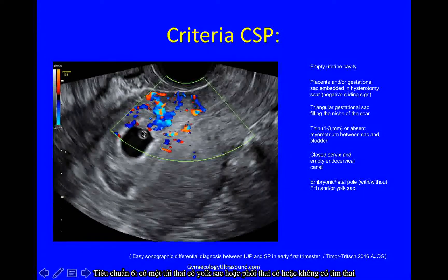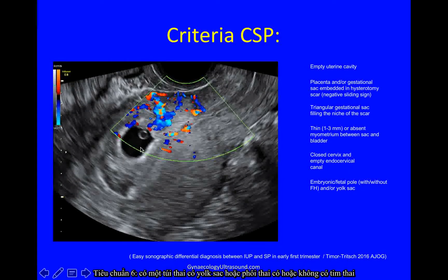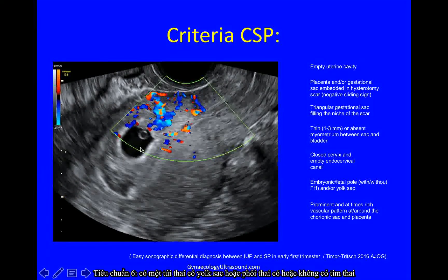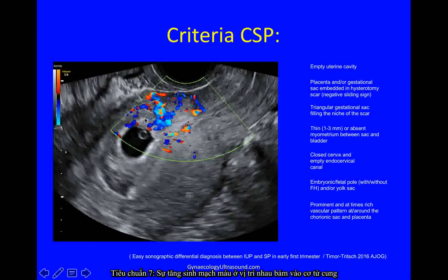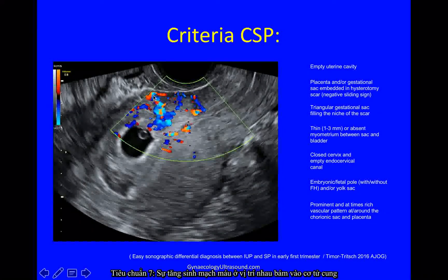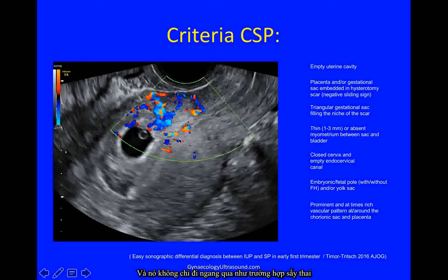Then you need either a yolk sac and/or an embryo with or without a fetal heart, and prominent vascularity showing that the trophoblast is embedded in the myometrium and not just passing through.